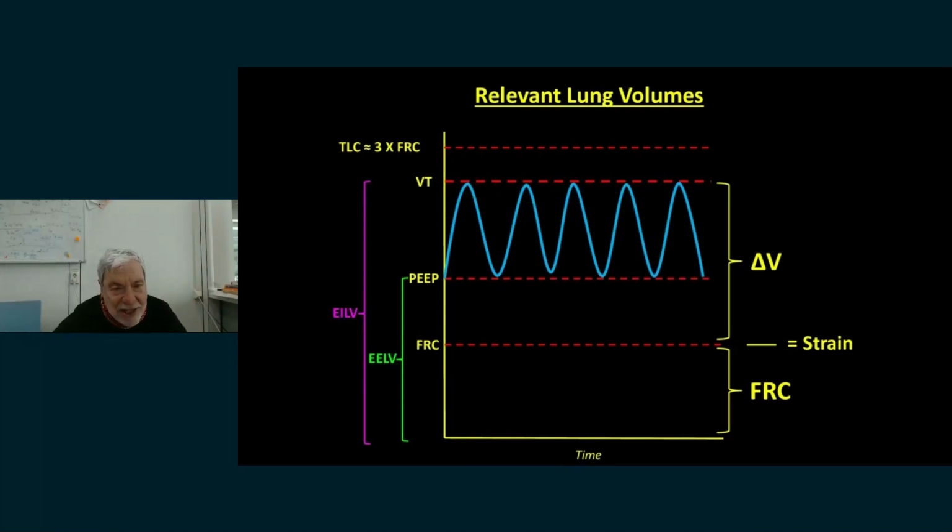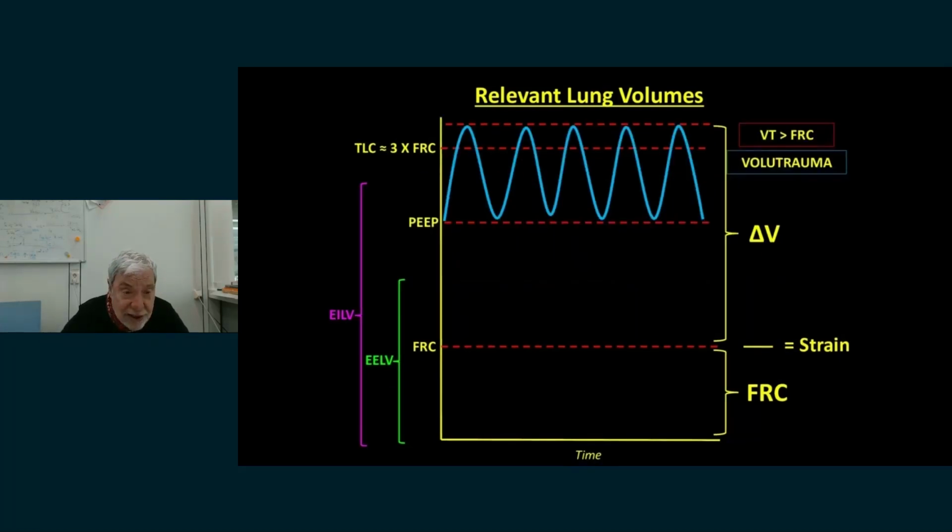My total lung capacity is about 3 liters. If my PEEP volume is 1 liter and my tidal volume is 500, I'm very close to here. And of course, when I have a further increase of PEEP at each tidal volume, my risk is to overcome the physical limit of the lung.